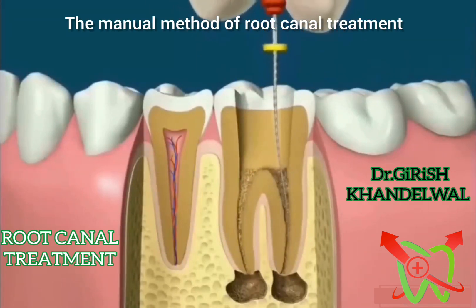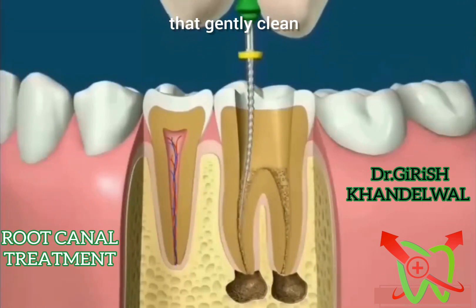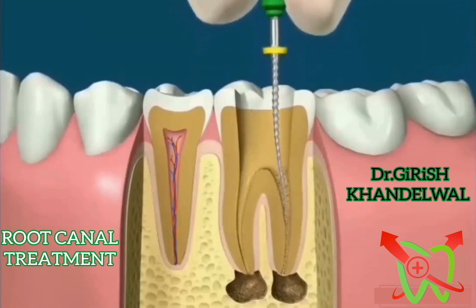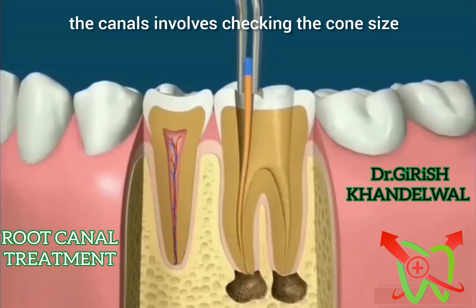The manual method of root canal treatment involves using increasing file sizes that gently clean and shape these canals. A tooth may have one or more canals. Using the manual treatment method, filling the canals involves checking the cone size.